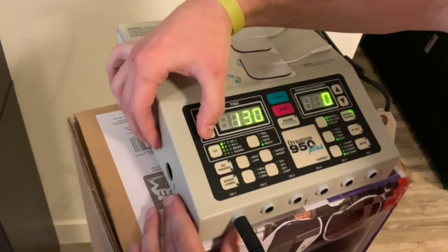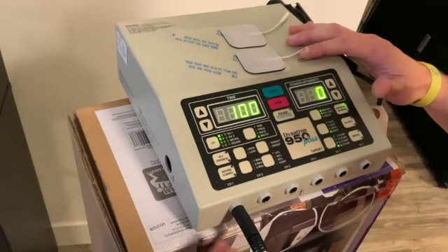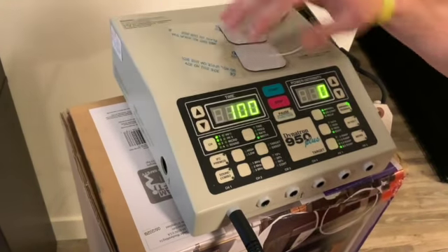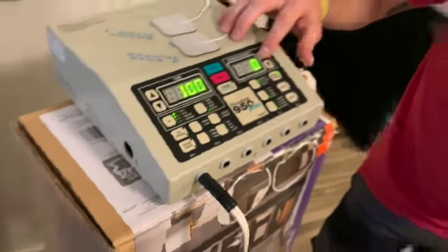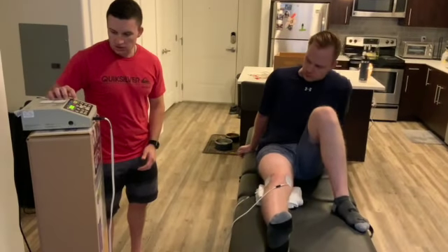Since we don't want to be stimulating muscle contractions or anything, we'll just stay there to stimulate the sensory nerve fibers. Okay, so what we'll do, Colton, is I'll start this up here for you. I'll start going up on the intensity first. So like I said, just let me know when you first start feeling it. Just a little tingly sensation. Okay.